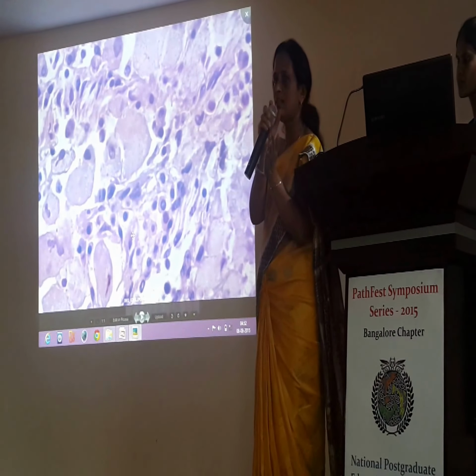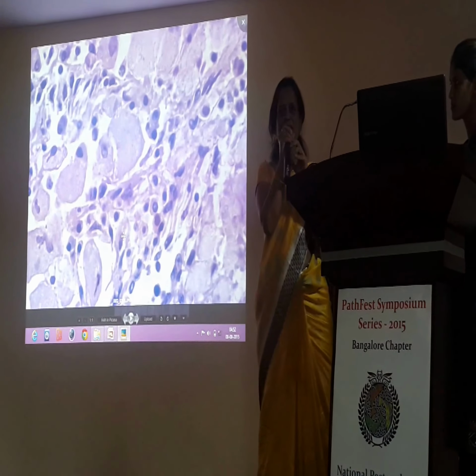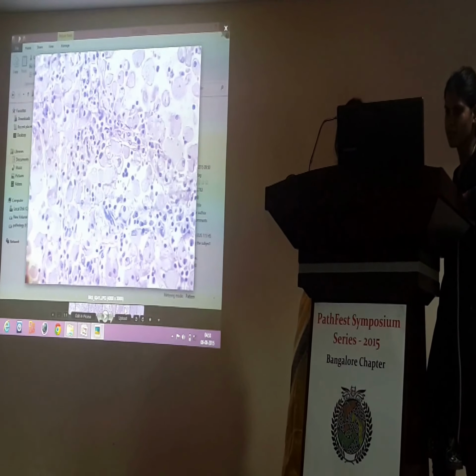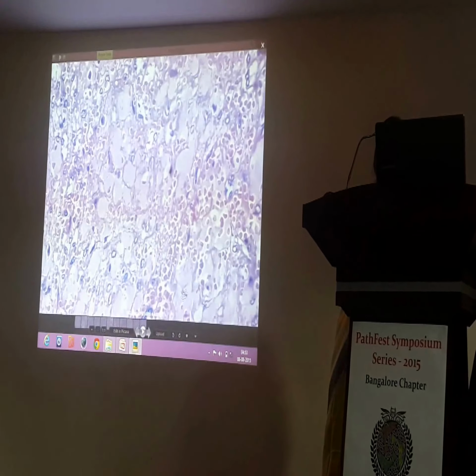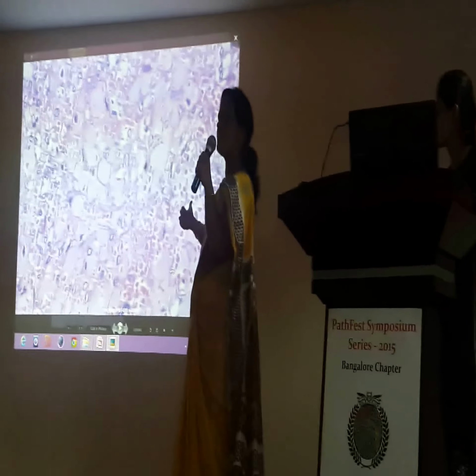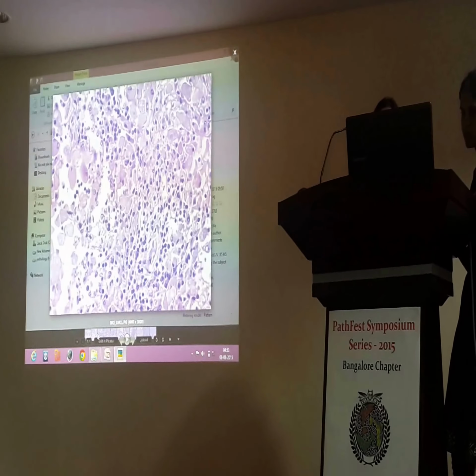Let us not deal with the disease proper. I'll just go with other cells I want you to identify. We are just at the morphology now. I think all this. So what is this area? This is congestion. Splenic congestion that you are seeing. Hardly there are few lymphoid follicles that are left.